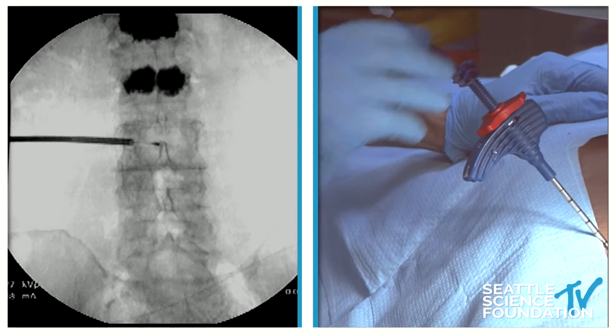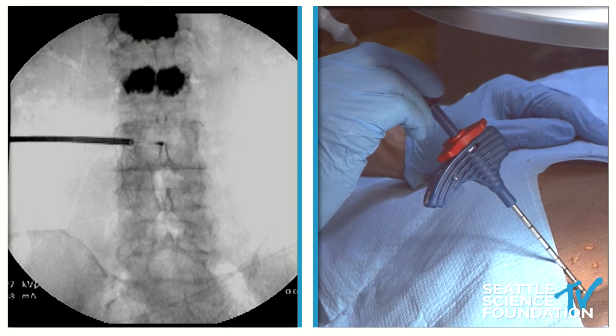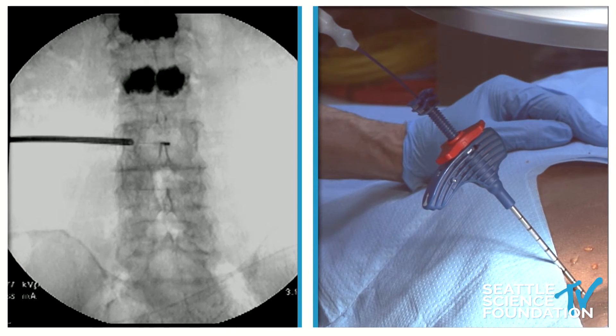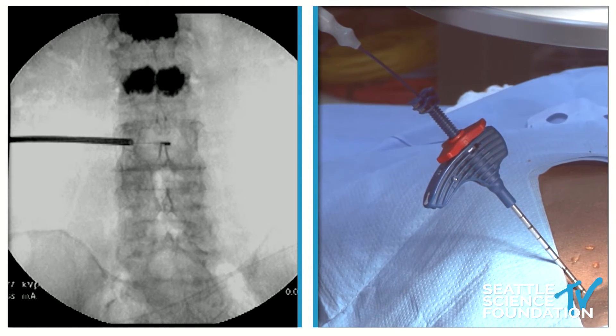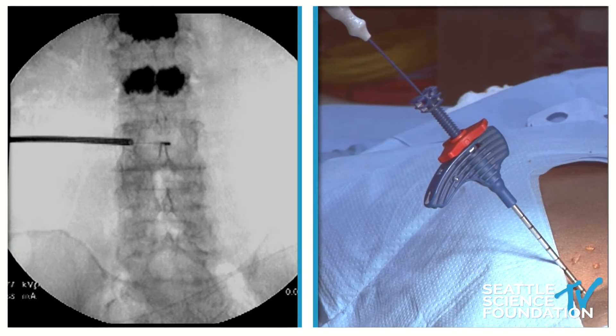We'll check the final position of the electrode. I'm going to wheel back just a tad and put that right in the center of the vertebral body. That is about perfect right there. I'd call that perfect. We'll go ahead and take a lateral shot to confirm the AP position on the lateral, and after that we'll burn. It's 15 minutes per level.